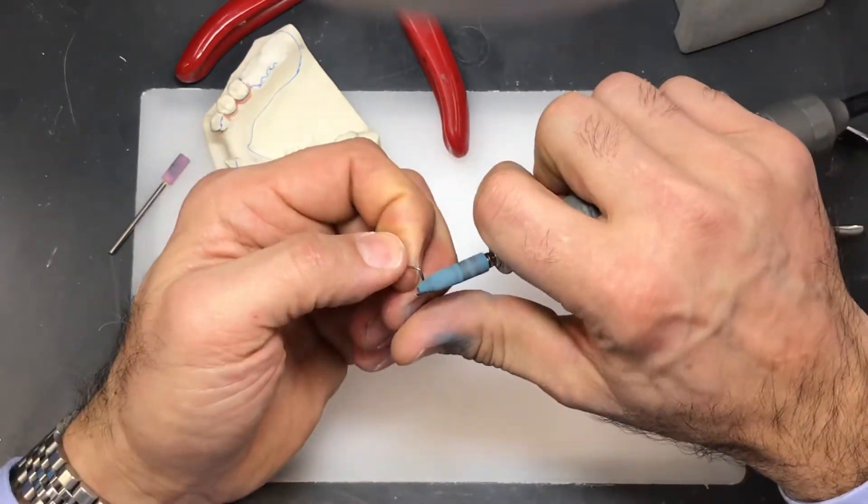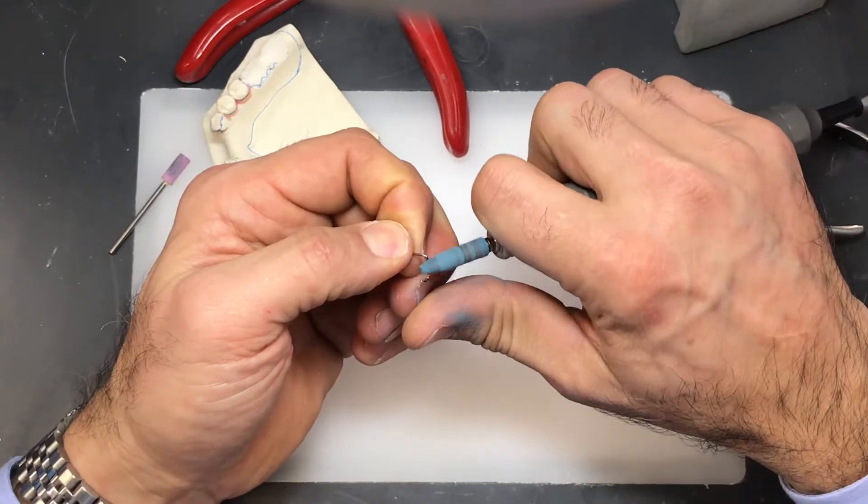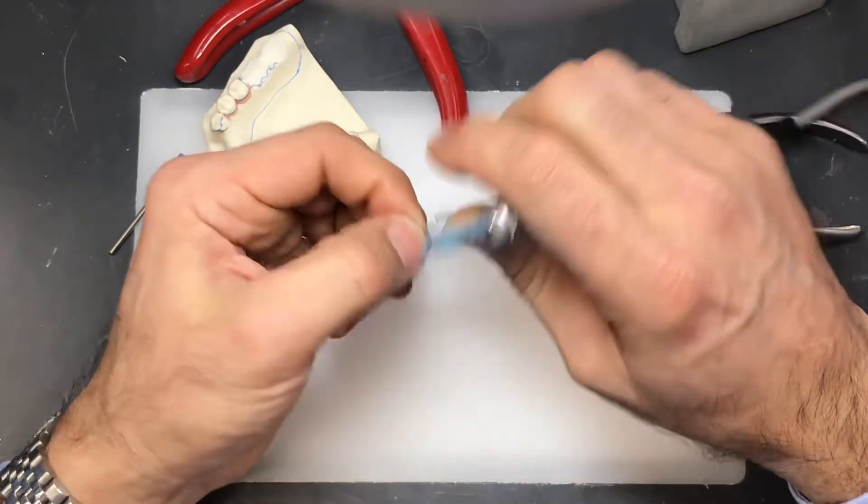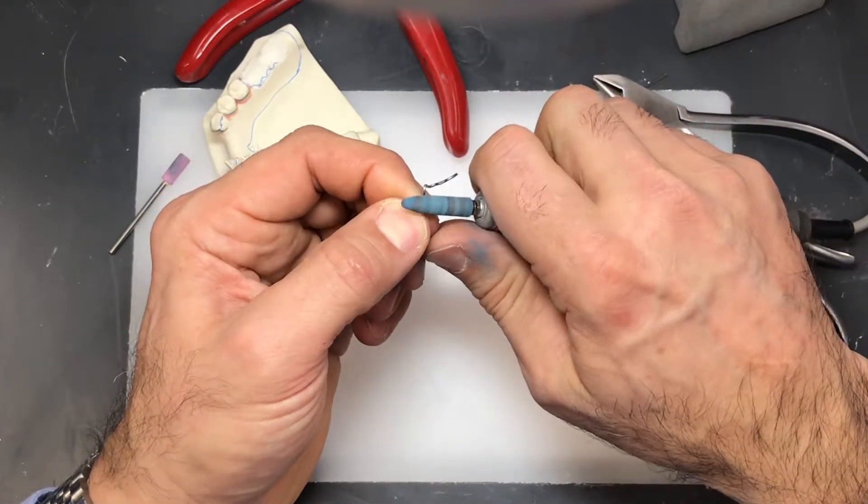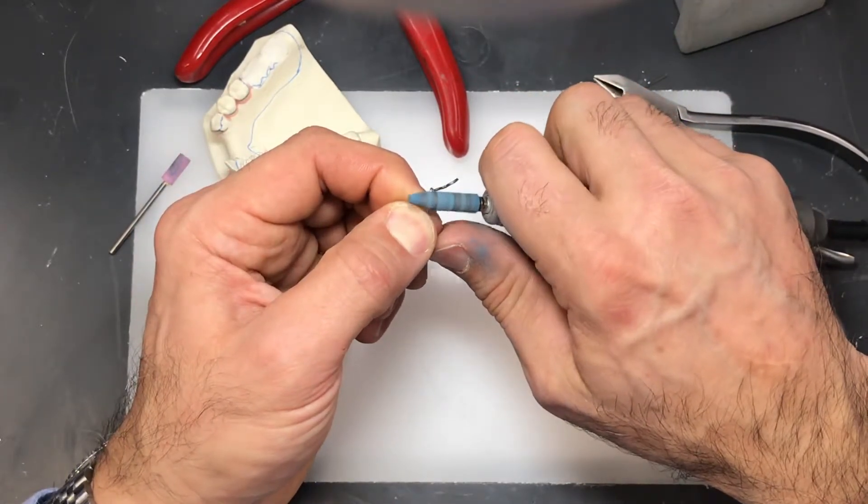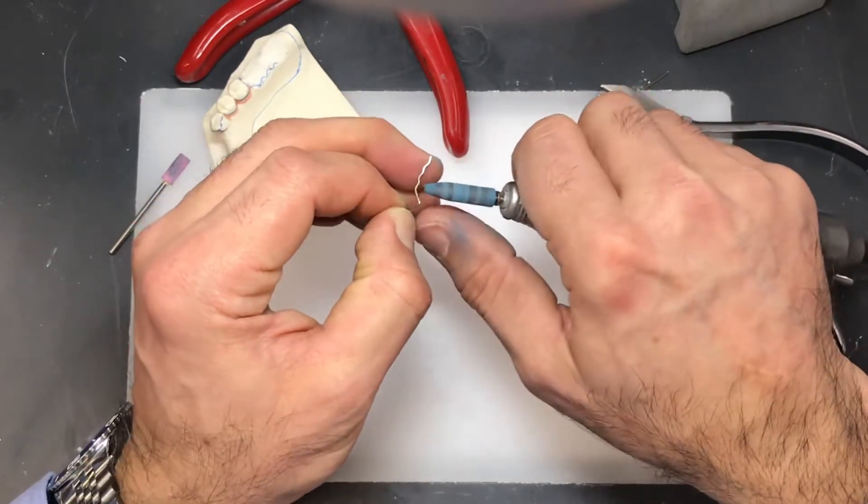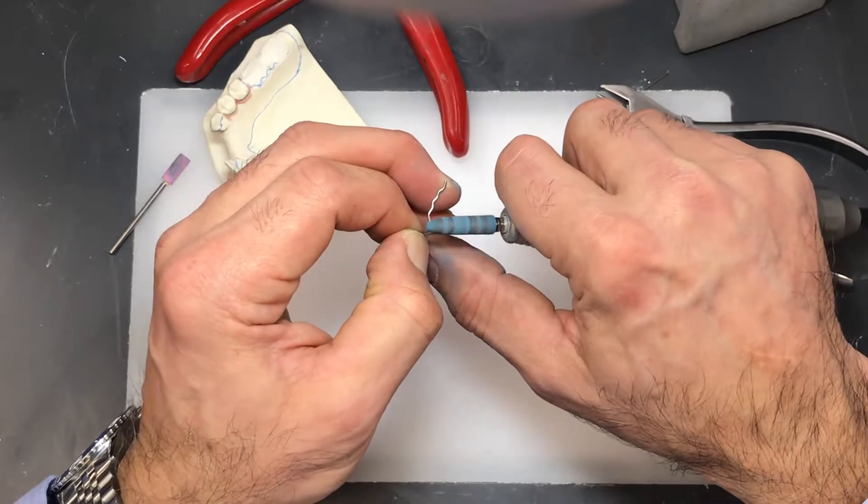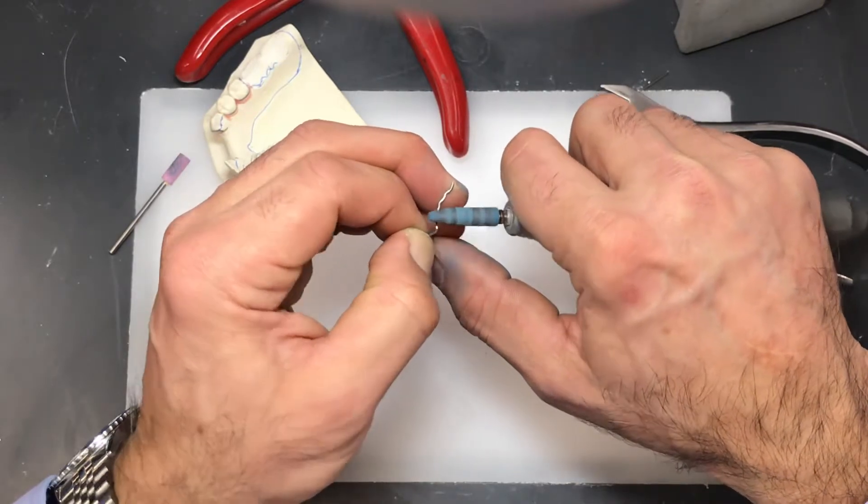I've created some nicks here on the wire so I'm going to take the opportunity now to round those off, to smooth those out. You don't need to do this portion because this is going to be embedded inside the acrylic.